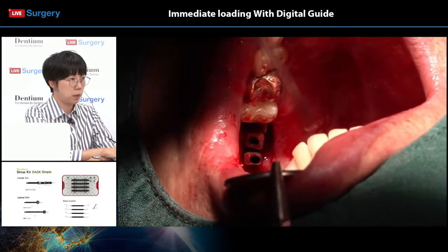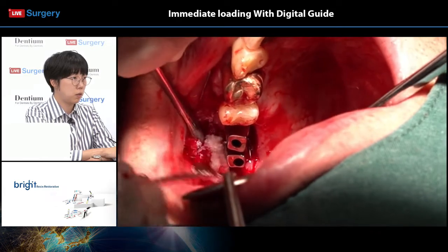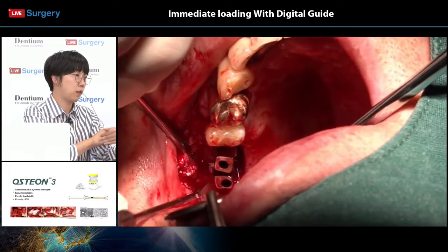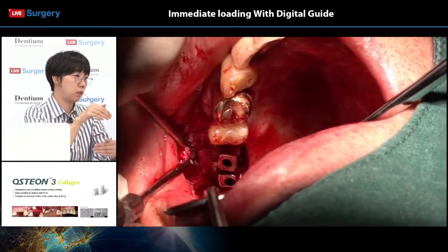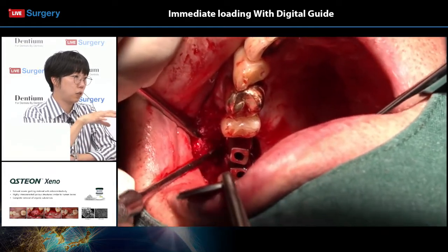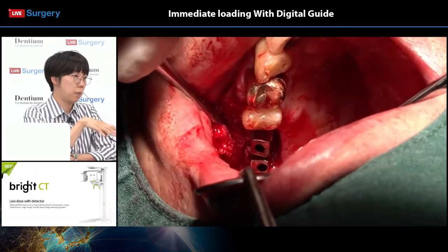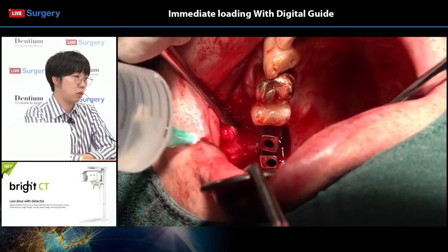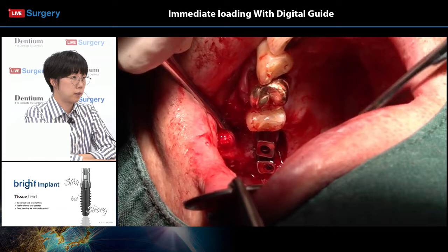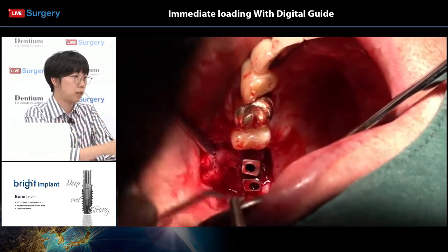So you can see that the membrane is still present under the buccal flap, and Dr. Lee is now reflecting the flap and the membrane at the same time using a periosteal elevator and putting graft material on the buccal side of the implant. After this, he will probably secure the flap as done in an apically positioned flap surgery procedure. So we will have a thick amount of keratinized gingiva on the buccal side.